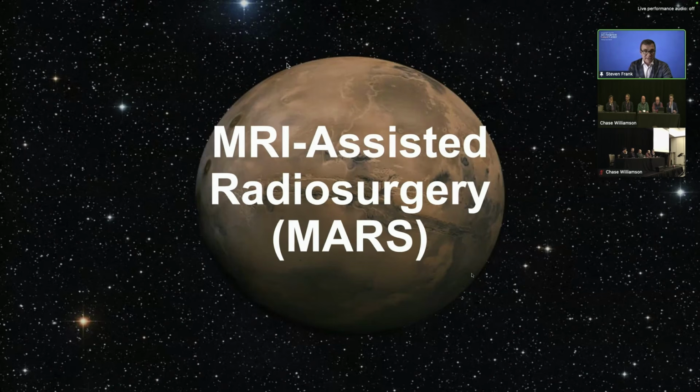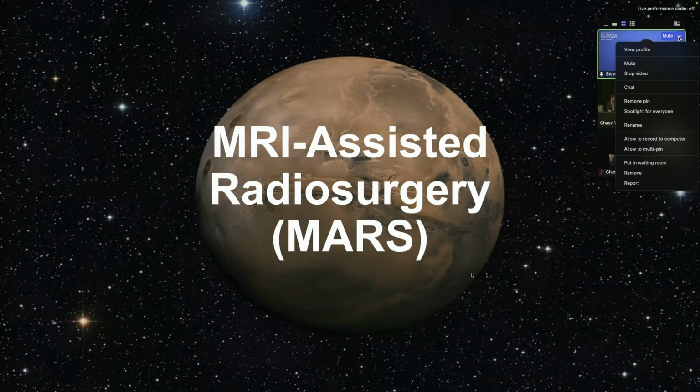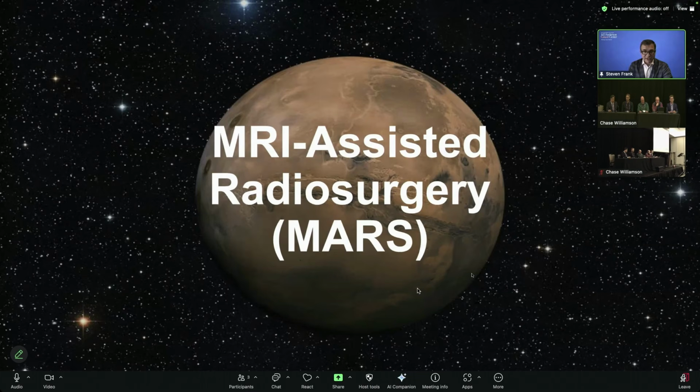It then takes roughly 10 minutes for our group to identify the seeds and provide me the information for post-implant assessment. I've found the seeds myself, too. We immediately pull those images into the MIM treatment planning software system, and then we have auto contouring and seed localization.